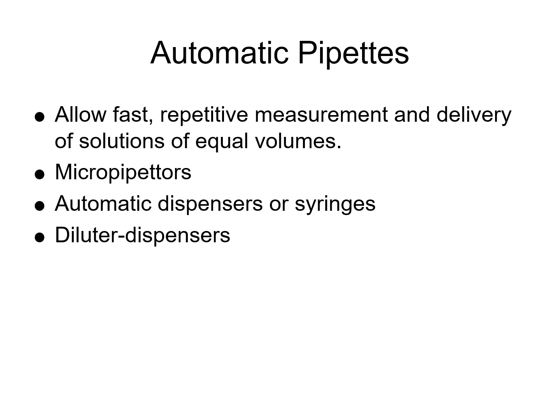For diluter dispensers, these are devices that dilute and dispense solutions simultaneously. These are common in serological titrations or assays requiring serial dilutions. This ensures consistent dilution factors and delivery volumes.